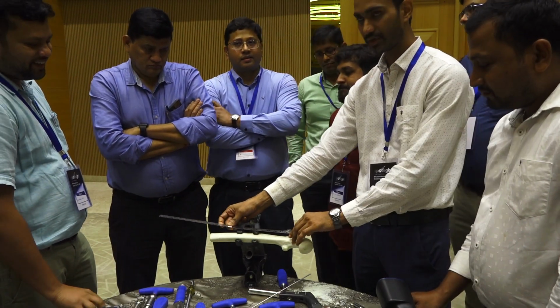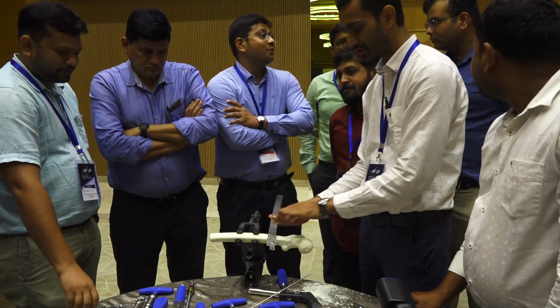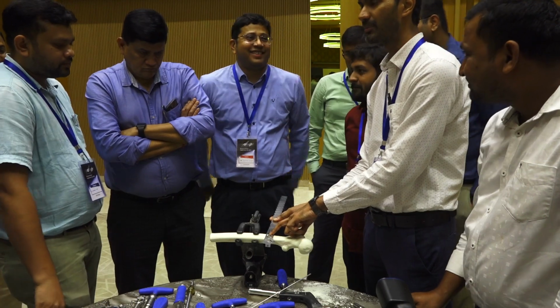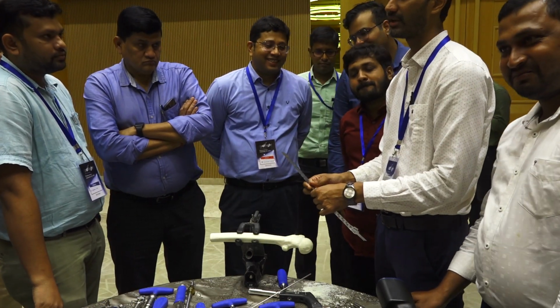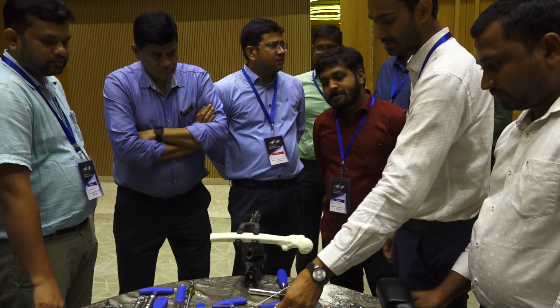So this is the ruler you have to check for the length as well as the diameter. You can put this on the diameter and see under the C-arm in which diameter is fitting. But in TFN, 10 mm, 11 mm is okay. You don't need to go to larger diameter nails.